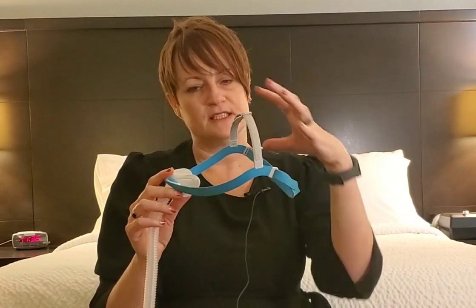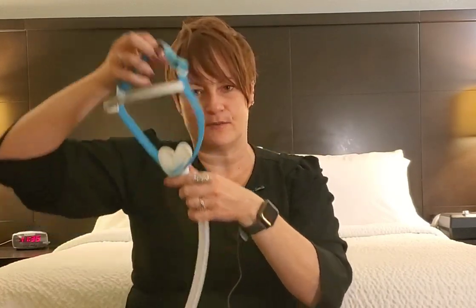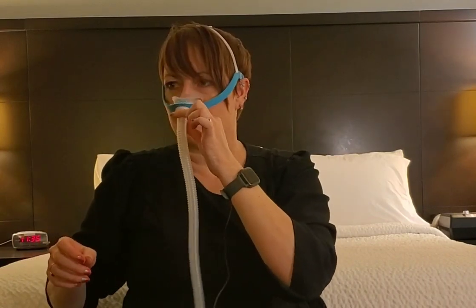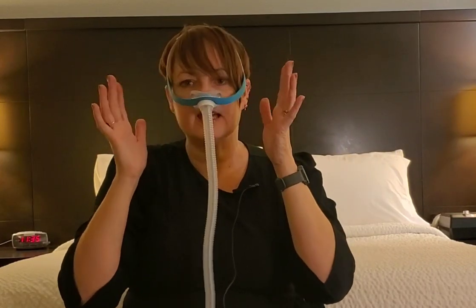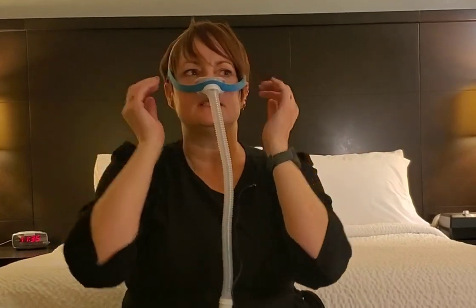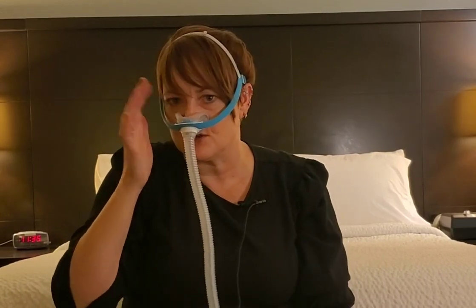And all of this hugs really well to my head and holds it tight without really putting tension on my nose. I feel like this is snug, but I don't feel like this is tight. And I feel like that's nice because it's really stable, but at the same time, it's not smashing my nose. I don't have any upward pressure against the bottom of my nose or nostril.